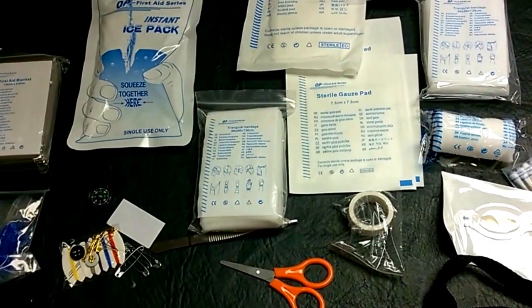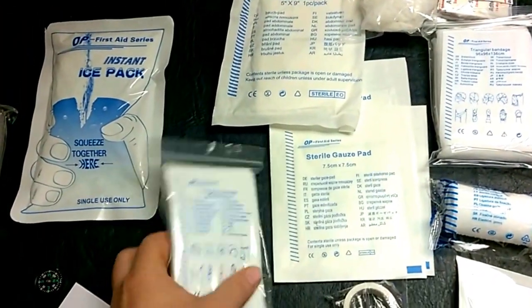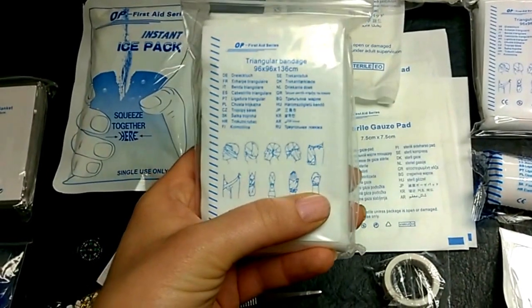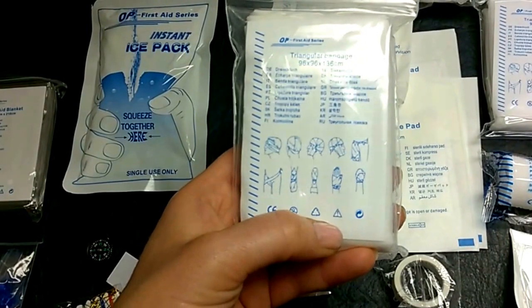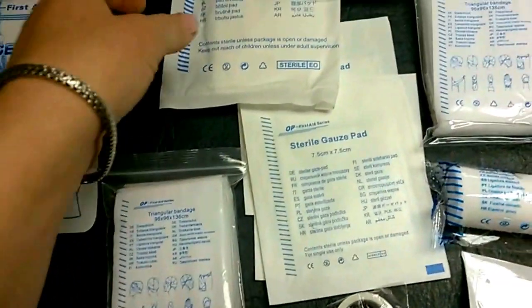You get scissors — that's typical. You also get a nice large triangular bandage, so if you have to wrap up anything large like your head, your thigh, or your hand in a really cool way — or apparently your groin. Good to know, good to know — look at the pictures.